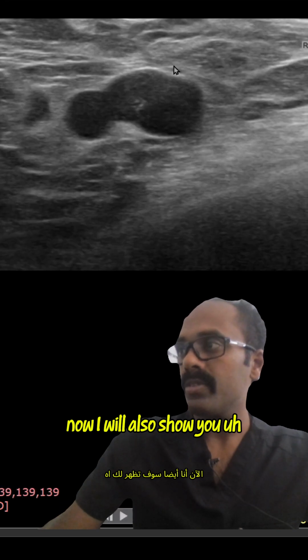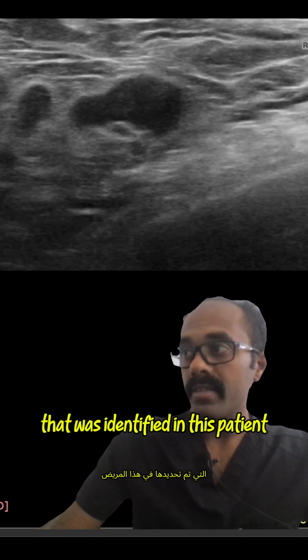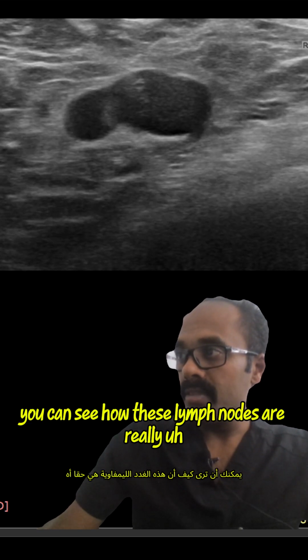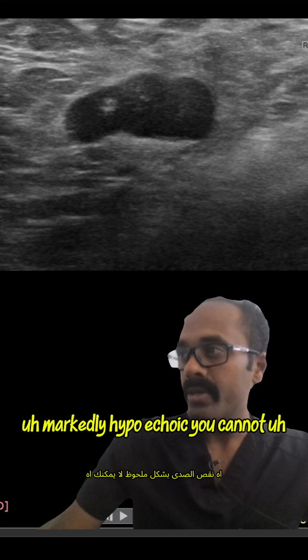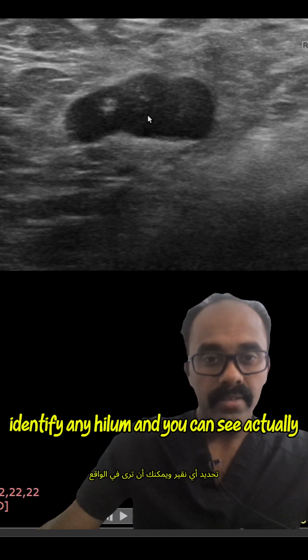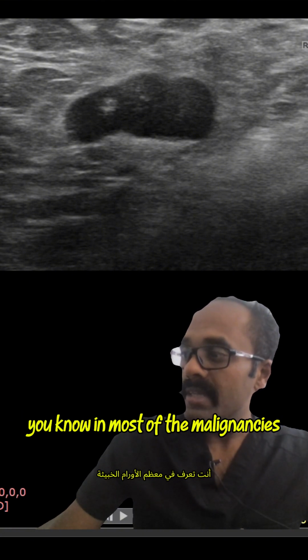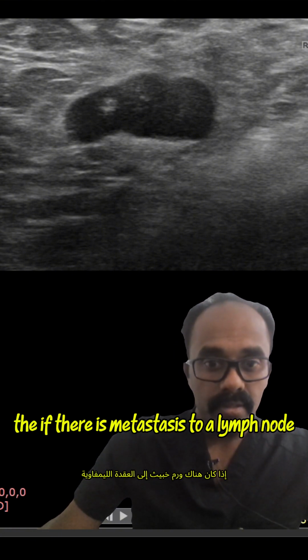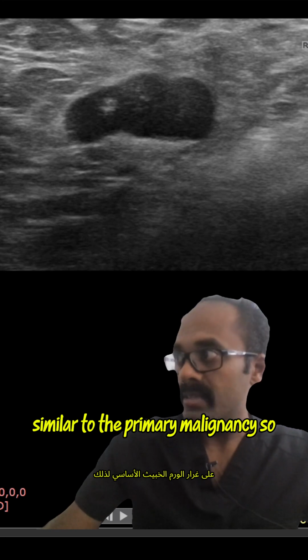Now I will also show you there were around 4 to 5 lymph nodes that were identified in this patient. You can see how these lymph nodes are really markedly hypoechoic. You cannot identify any hilum, and in most malignancies, if there is metastasis to a lymph node, the lymph node also tends to demonstrate a morphology similar to the primary malignancy.